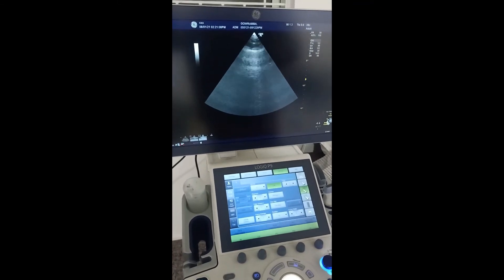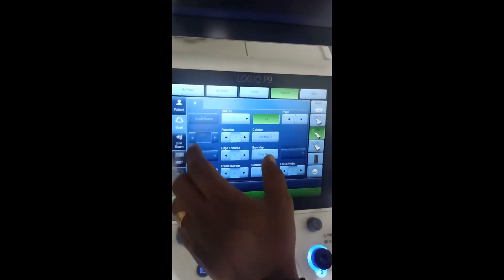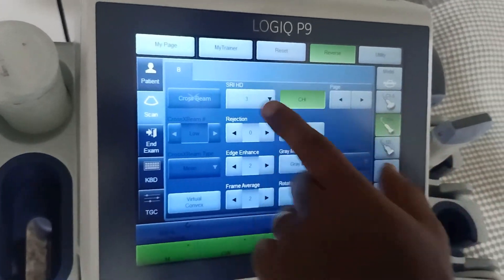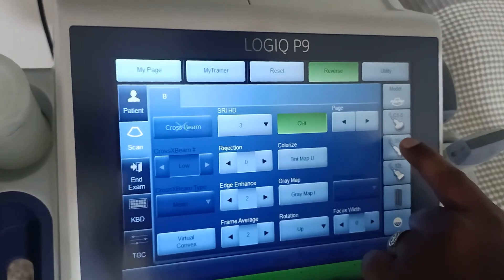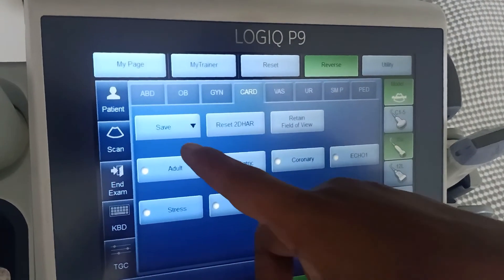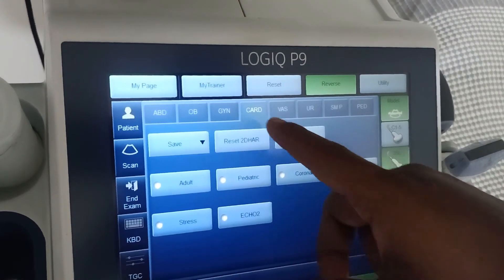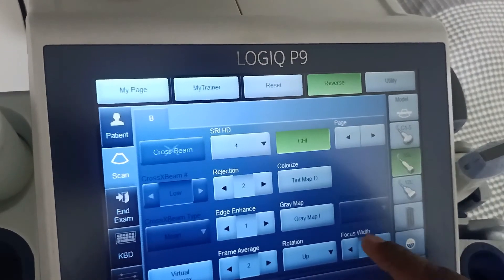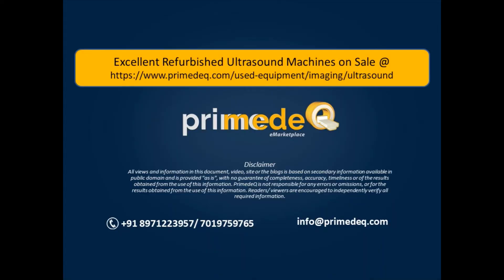This is the cardiac scan, and here you can see the patient scan. These are the scan presets — what presets are presently available. That is B mode. So whenever you change the probe, each time we have to check what presets are present. The present presets for the 3S probe — you have to select here. You can see cardiac and vascular. We need cardiac, so select cardiac. This is the cardiac process we have to select for an accurate cardiac scan in B mode.